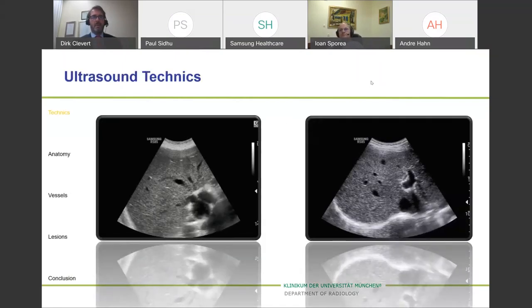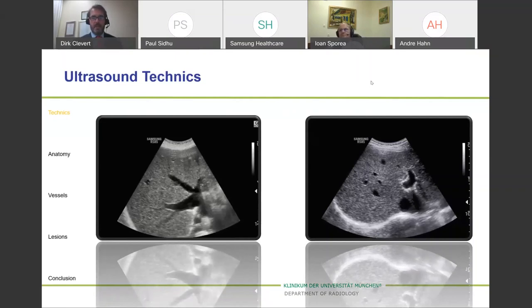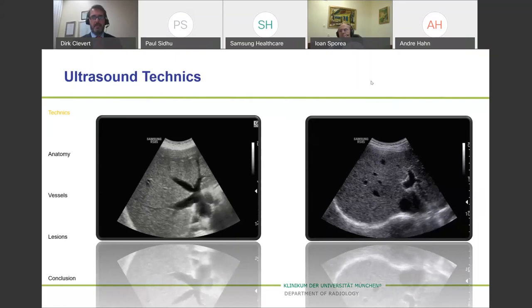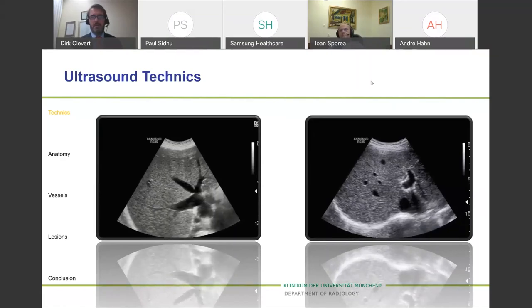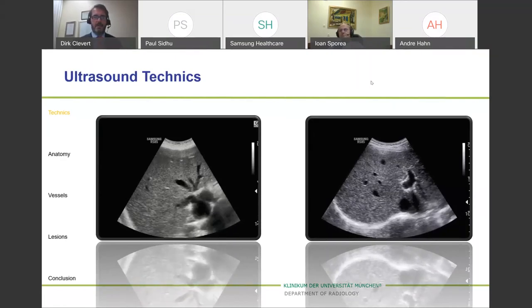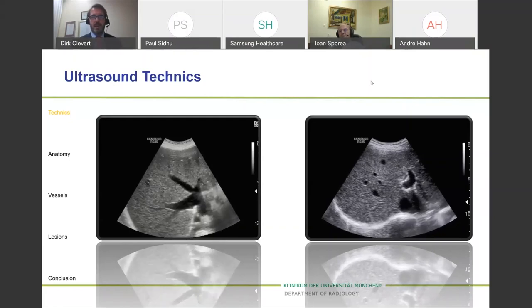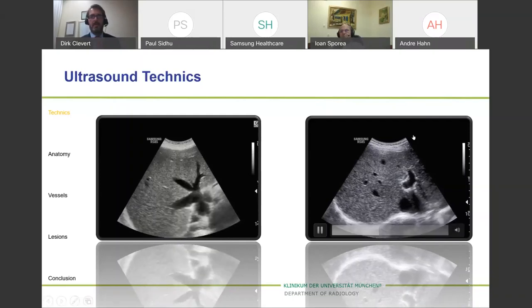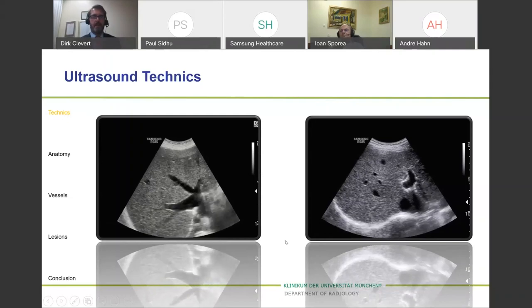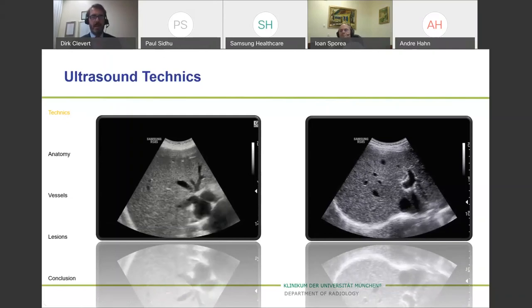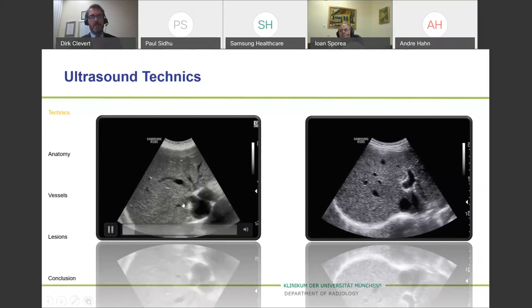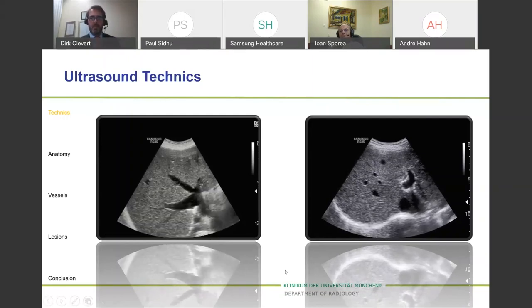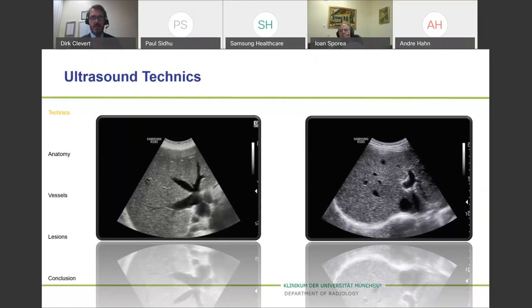When we start ultrasound, every grayscale examination starts with a conventional grayscale as seen here. Looking at the image on the right and left side, this is an image without any optimization. Every fancy tool like harmonic imaging and speckle reduction imaging is switched off. There are no advanced techniques available, so you see more speckles. Sometimes you don't see the vessels completely dark — this is just the fundamental raw data from the grayscale received on the monitor.